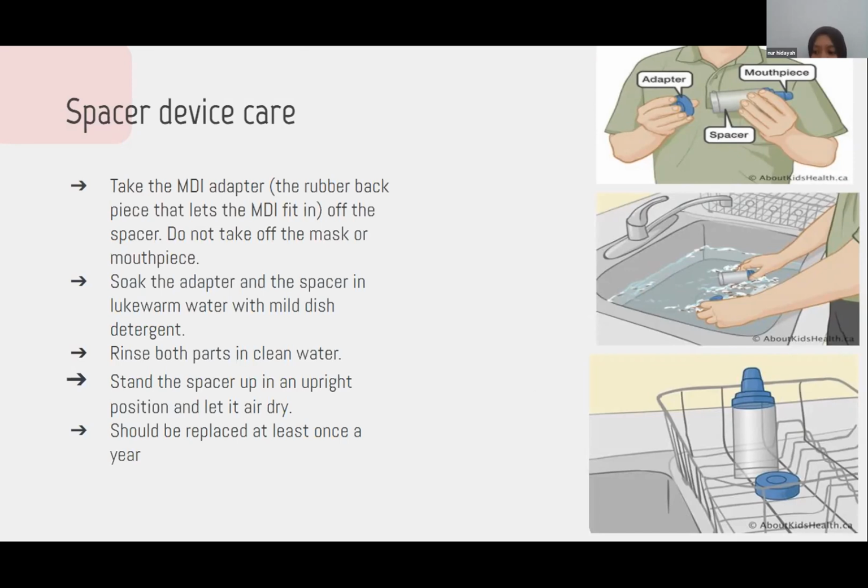And caution, do not rub the internal surface of the spacer with a brush or cloth, as it will damage the surface of the spacer. And the spacer should be replaced at least once a year.